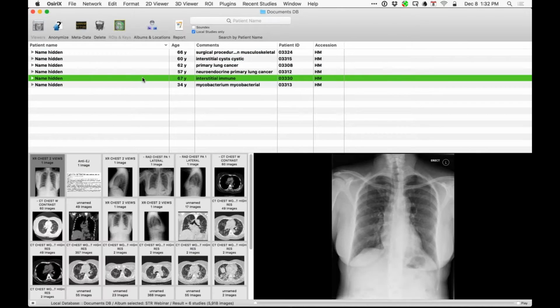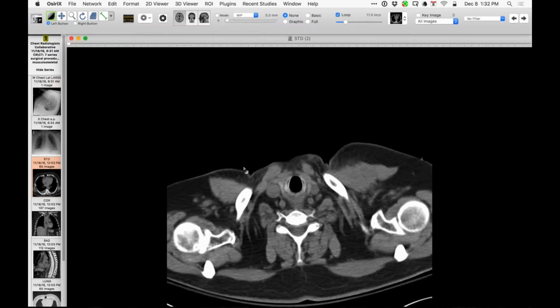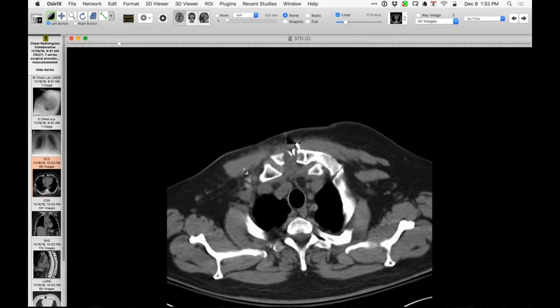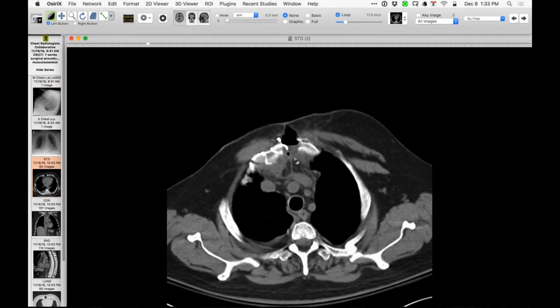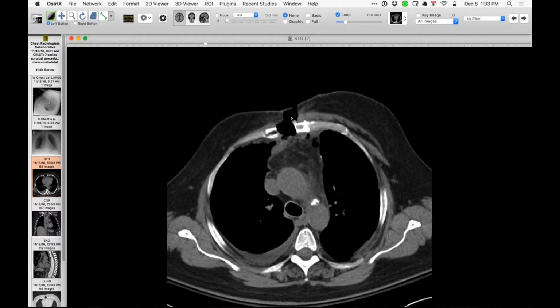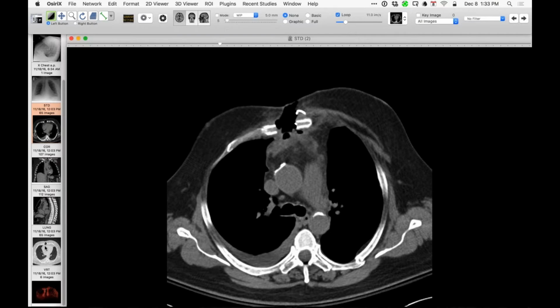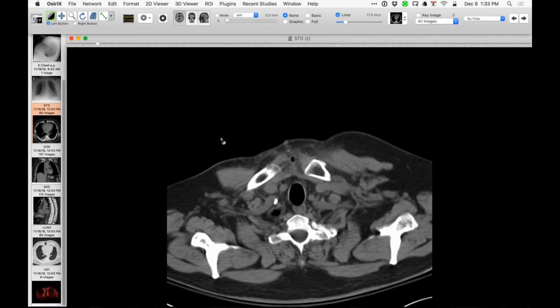Howard, did he have mediastinitis and an infection, or was it just from sheer trauma force? I don't really know why the wires tore out of the sternum. There's a little bit of fluid and a touch of air, but no discrete abscess or anything like that. And you can see there's a little incision there, but no, this is just what it looks like. It just tore out like that. I wonder if there was vigorous coughing or something like that that really stressed it. I don't know what happened.